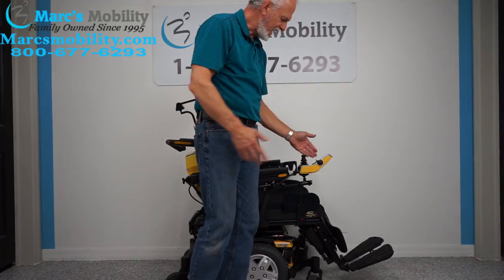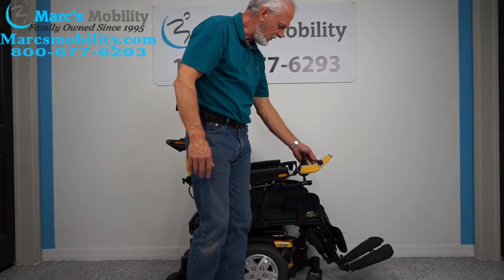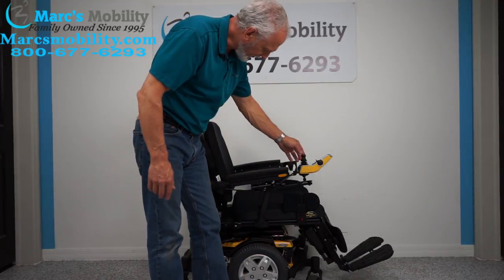Now I'm going to switch out of this picture, go back to the driving mode, and go to fast. Let's look at what else this chair has.